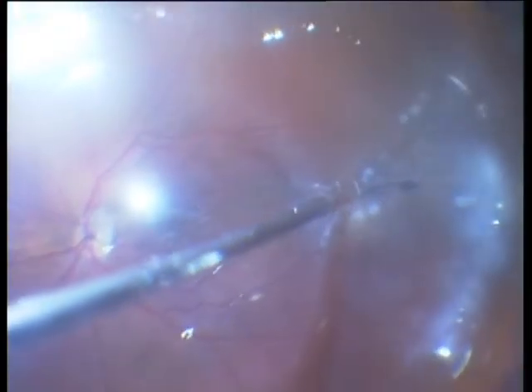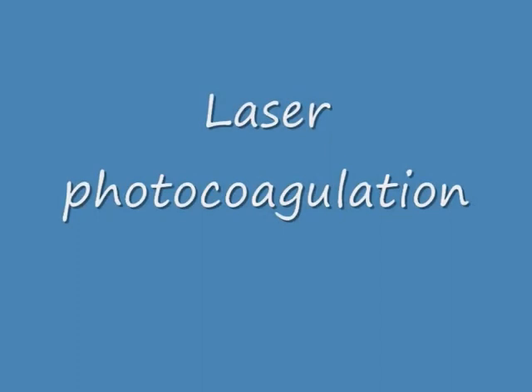This is the final part: fluid-air exchange, and then laser photocoagulation. I think that the pathology was going on for a much longer time, if you think of these thick membranes. Tamponade is silicone oil. I am not using gas because of this PVR detachment — for me, this is preferably a silicone oil tamponade for these eyes.